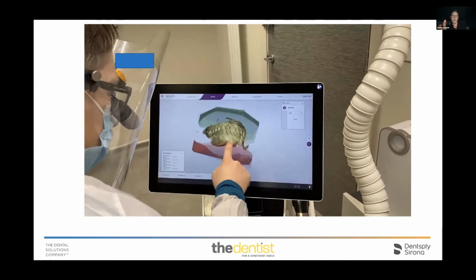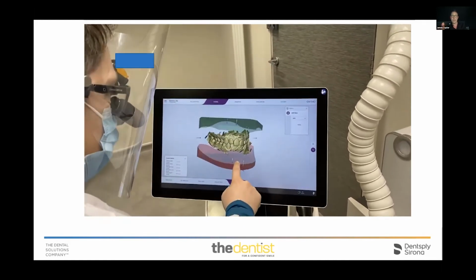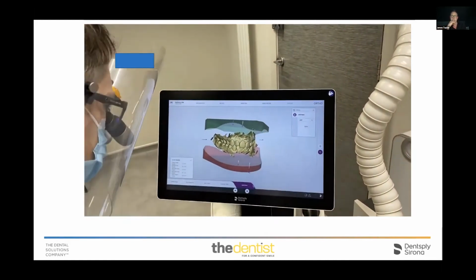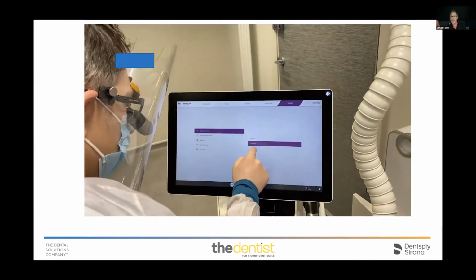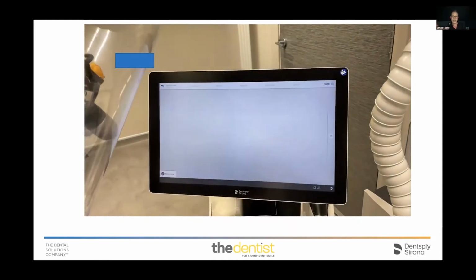I know exactly where I am. I can really look at it as you would do with a normal orthodontic case. Models are produced. You can keep those models, look at them at any time, but essentially then you're sending them to SureSmile, and that's really it. That is as quick as that to get your models scanned, detailed, mount them essentially, and then move them straight to SureSmile for them to then go to the next stage.